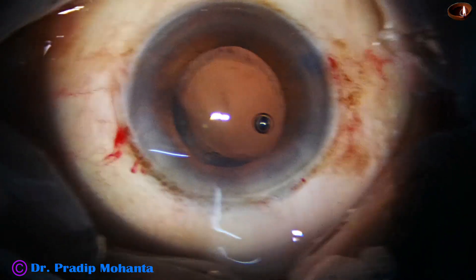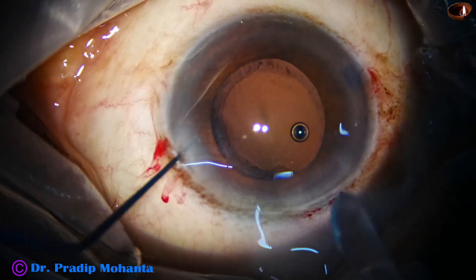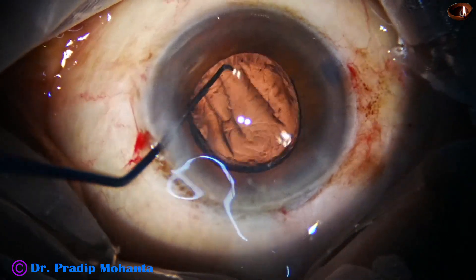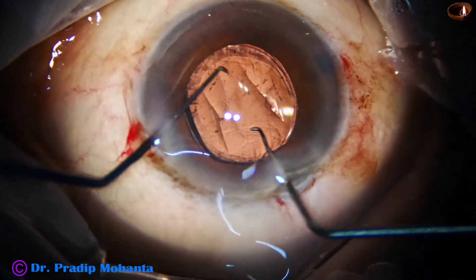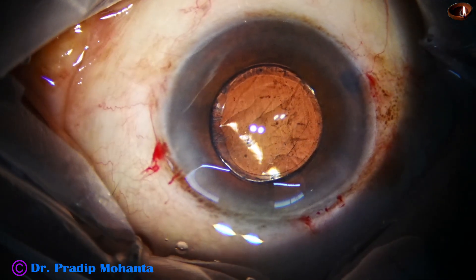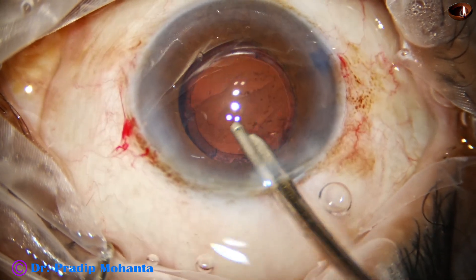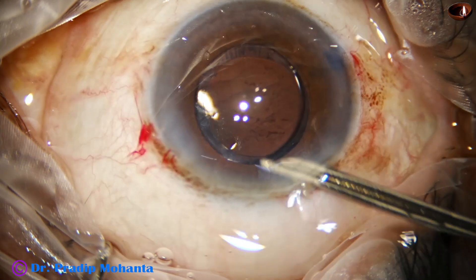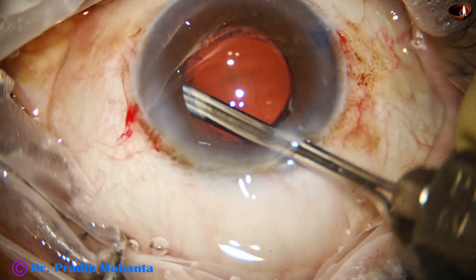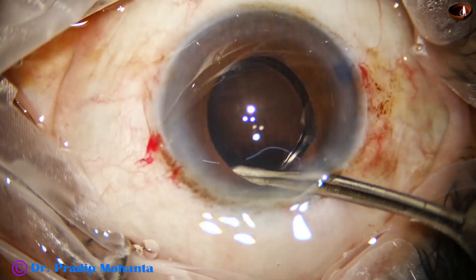We inject some visco and are going to implant a single-piece lens in the bag. This is a single-piece monofocal hydrophilic intraocular lens. The lens is dialed with two instruments — this bi-manual dialing is very good. Now is the time to clean the viscoelastic used for implantation. I go behind the lens and then come in front for irrigation and aspiration. At this time I am removing some lens fibers as well.